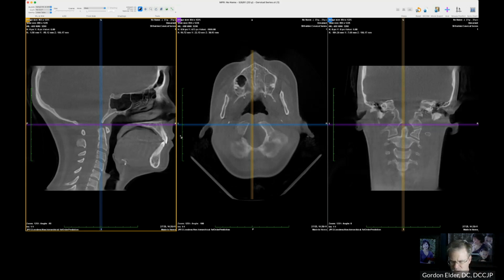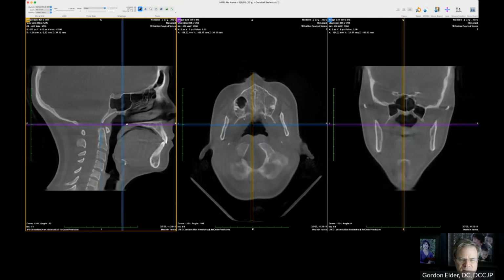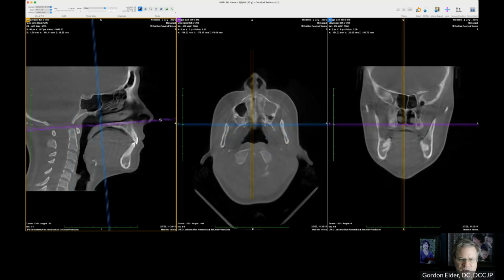So I wanted a three-dimensional reference point that was different. What I decided to start off with, I needed something that I could reference from the outside. So when I walk up to the patient with my protractor, I have a point of reference on the outside that's going to be pretty close to what's going on the inside. And the dental profession tells us that the hard palate is fairly equal to either the top of the external auditory meatus and the bottom of the orbit, or where the ear attaches to the skull, to the corner of the eye, somewhere in that region. And I found out some things.